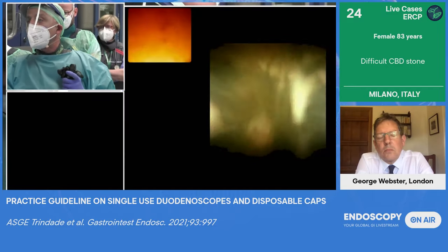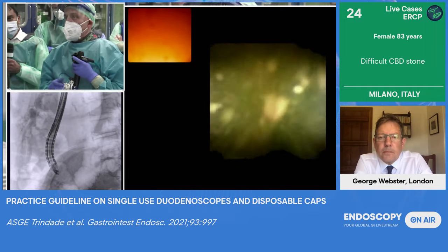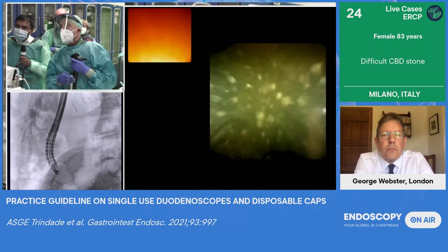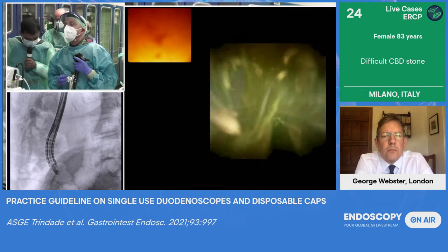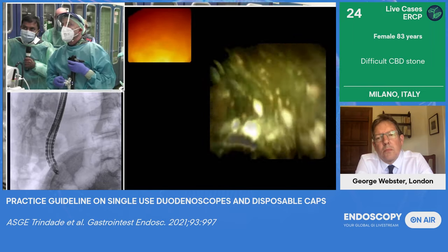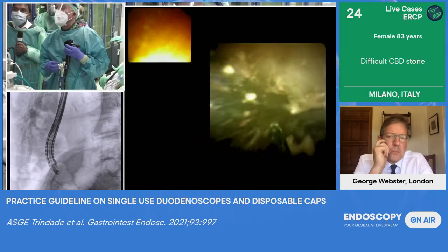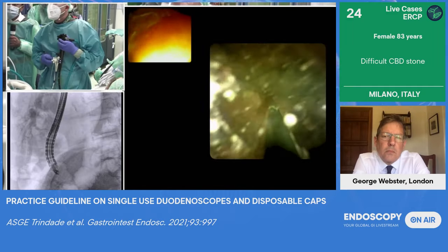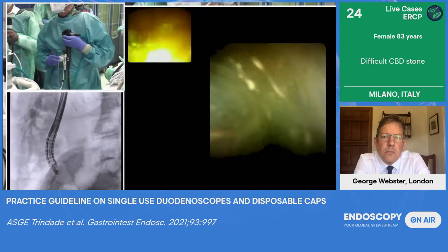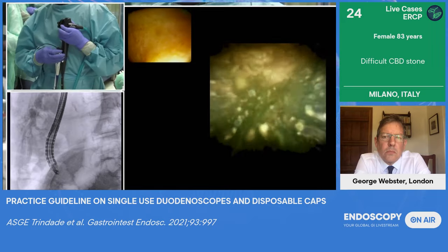So we are able, hopefully, to break the stones at least in two parts. And this is very important for the removal of the stones. I'm applying a medium energy with the Autolith generator, and I'm giving 15 impulses each time I apply the pedal. And as you can see, we have already reached a very nice effect. So I always come back trying to give some more shots. The smaller, the better sometimes. And let's see.